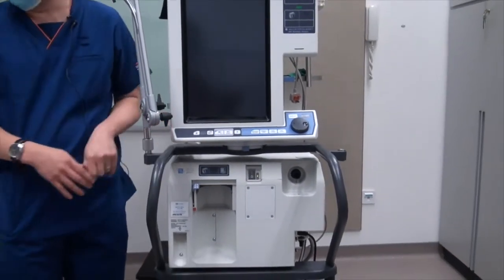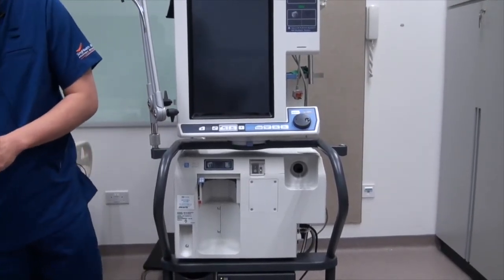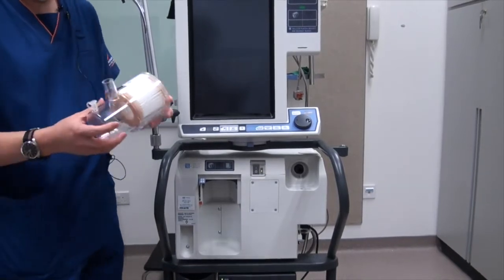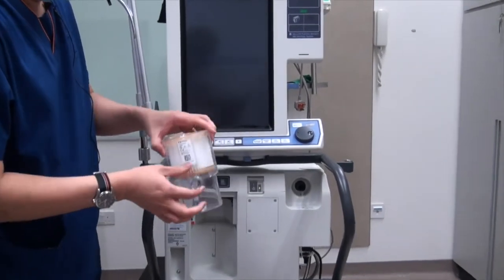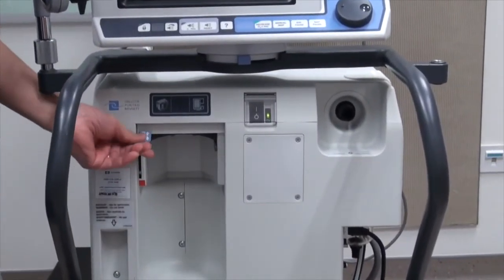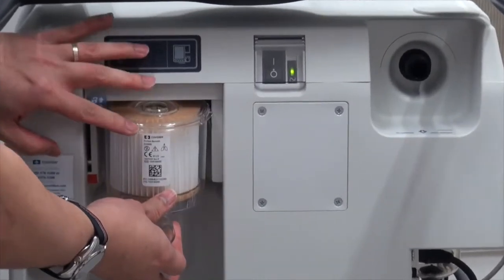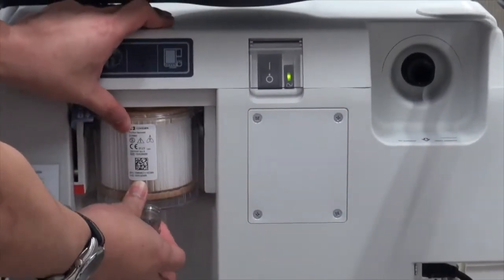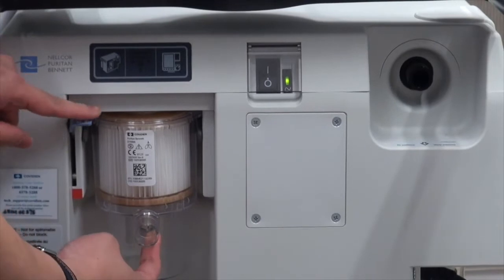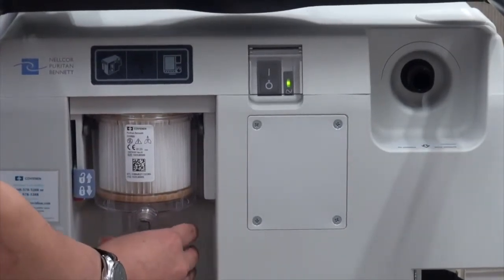I will now demonstrate how to put in the different components onto the ventilator. The first is the expiratory filter. There is a lever at the side — first, you need to lift this up, align the filter in so that it fits snugly into the container, then push the lever down, and make sure that the filter is secure.